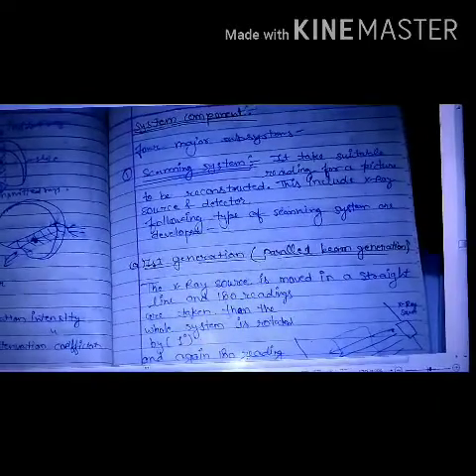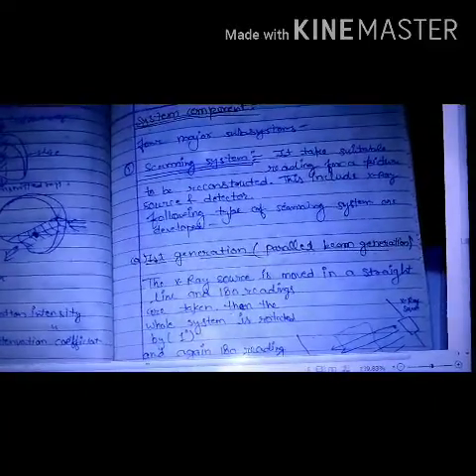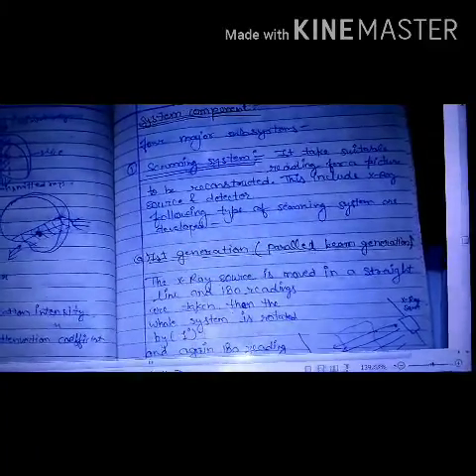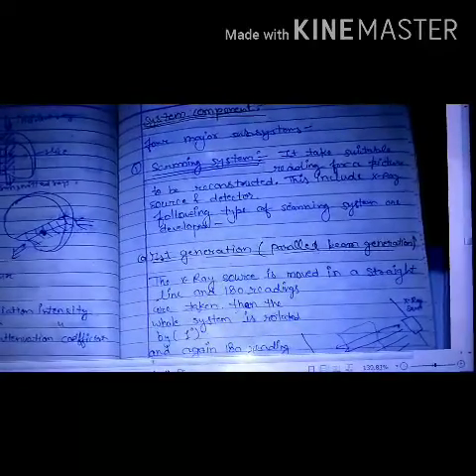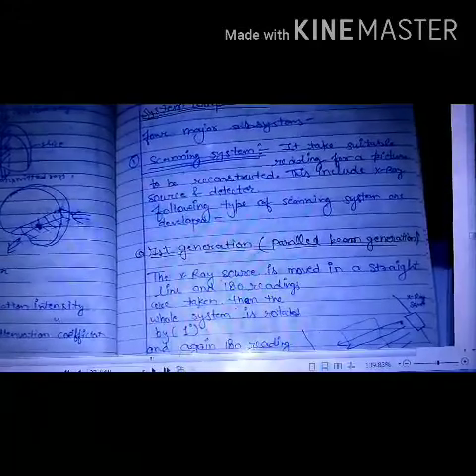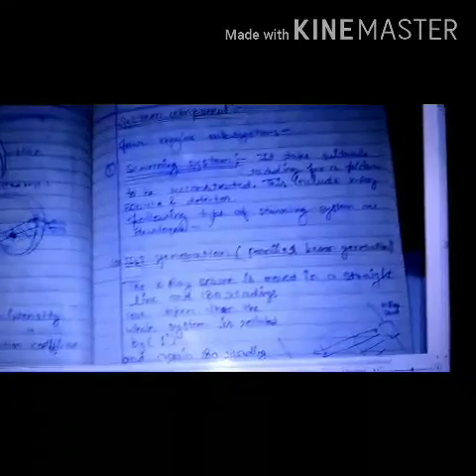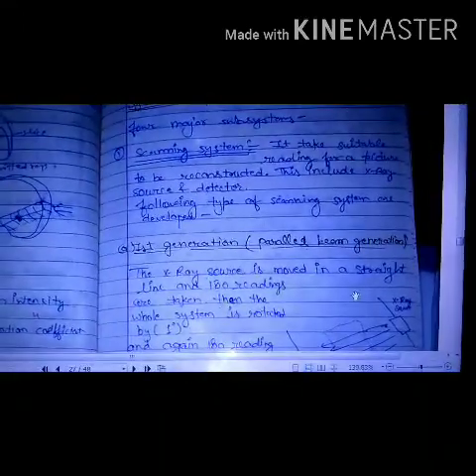So depending upon the readings, we can improve the quality of the imaging which has been generated through CT scanning. So this is about what has happened over the period of years from our first generation to 5th generation scanning machines. So let us take a look at these different generations.